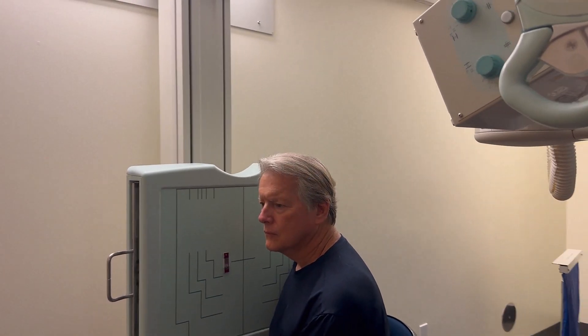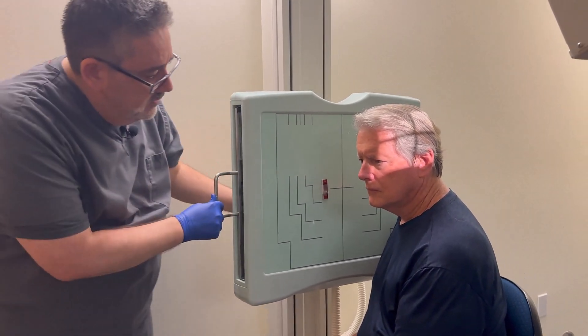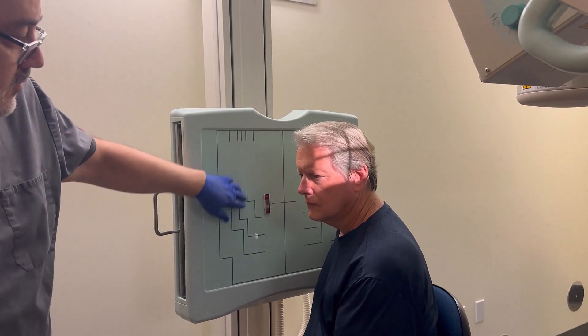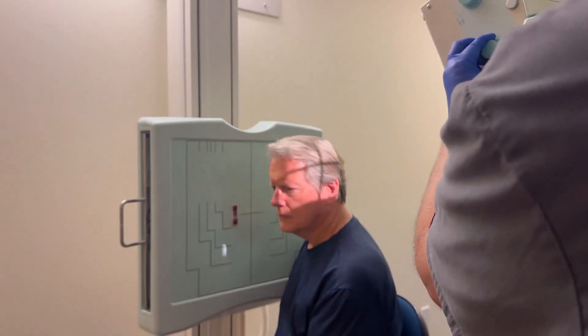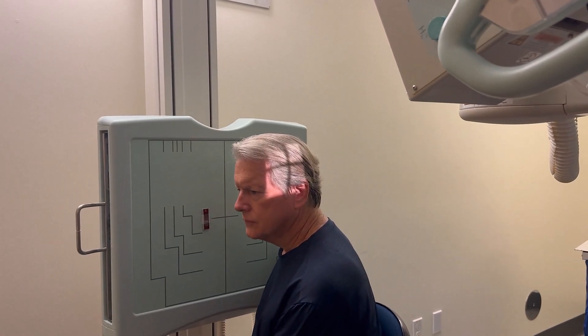Tuck your chin in please — we're going to get the IOML parallel to the floor. I think I'm a little high, so just drop it right there. Then I'm going to recenter my bucky. My marker is pretty close in, but just remember the TMJ is about as big as your pinky, so if you're centered right, I've got plenty of room between it and the marker. I'm doing about a three by three field — that's pretty much all you need. Take on suspended respiration.